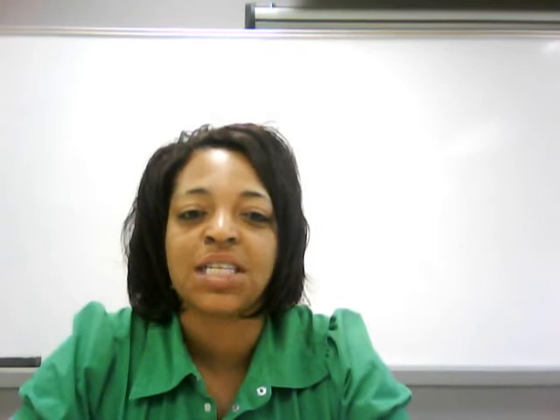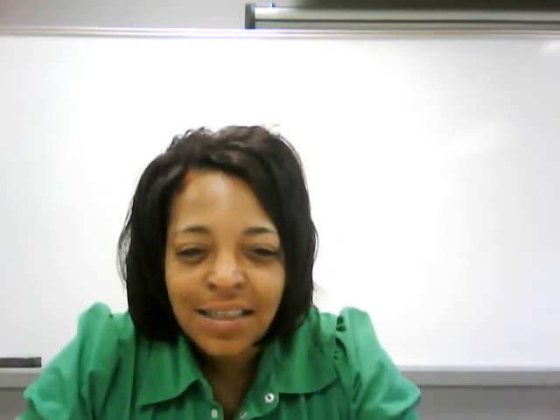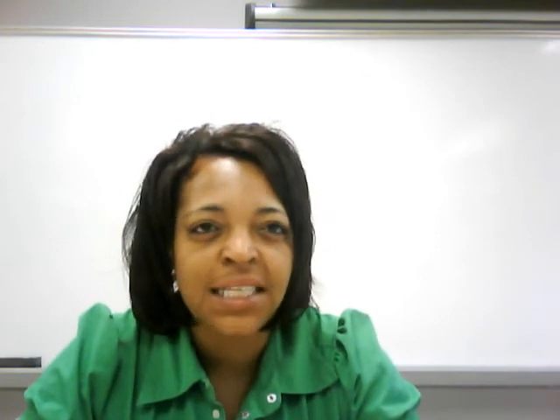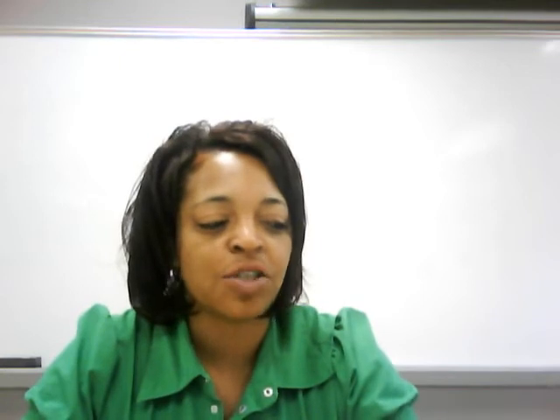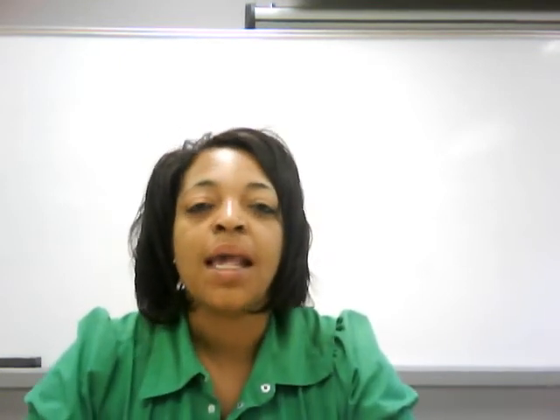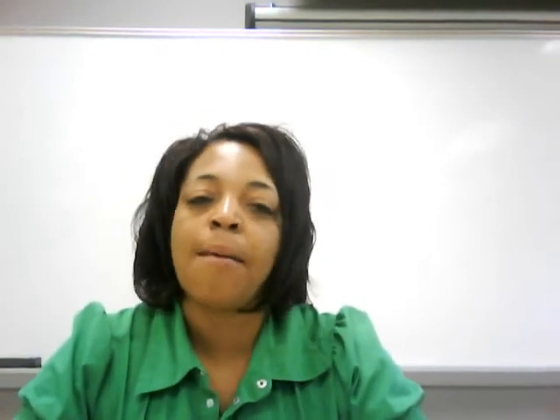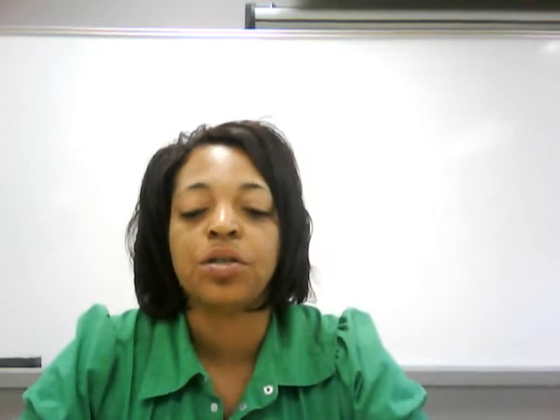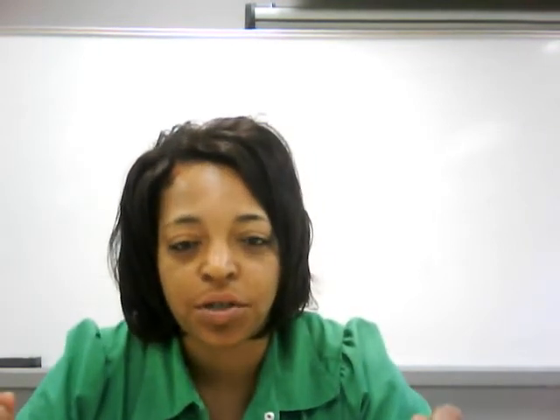And maybe our resolution is not what we want it to be if it doesn't look quite as sharp, or we can't see the little fine markings or something like that on the picture. That's going to be a bad thing with our resolution. Okay, now if you want to see something in a picture that shows good detail, a lot of people tend to bring it closer.